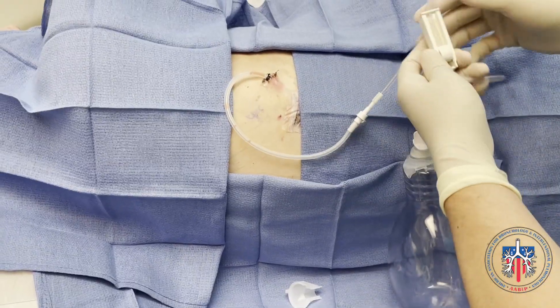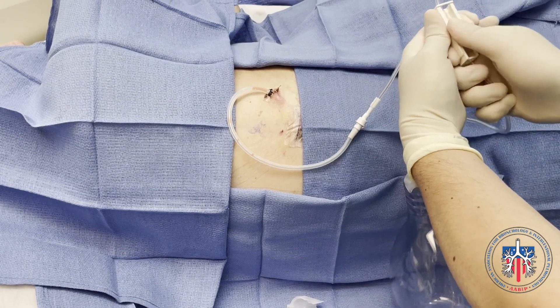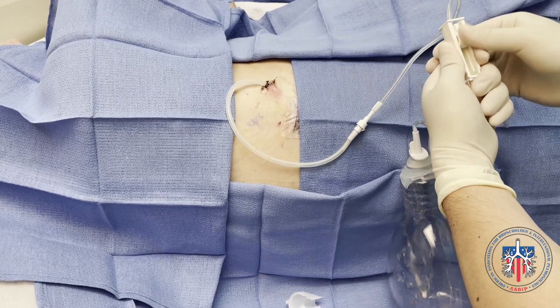The drainage dial is then moved to the up position to unlock and allow for pleural drainage through the drainage tube. We can leave the drainage dial open completely in the up position, or leave it in the halfway position to allow for slower drainage.